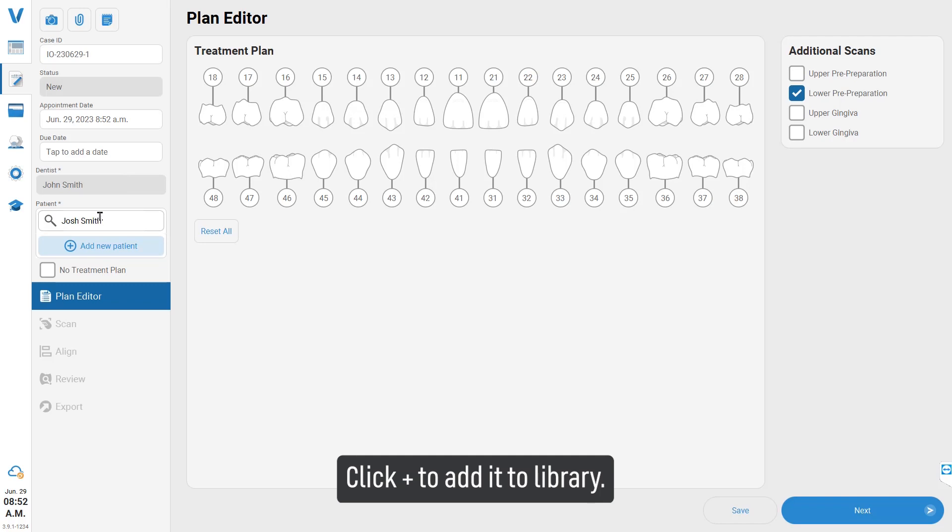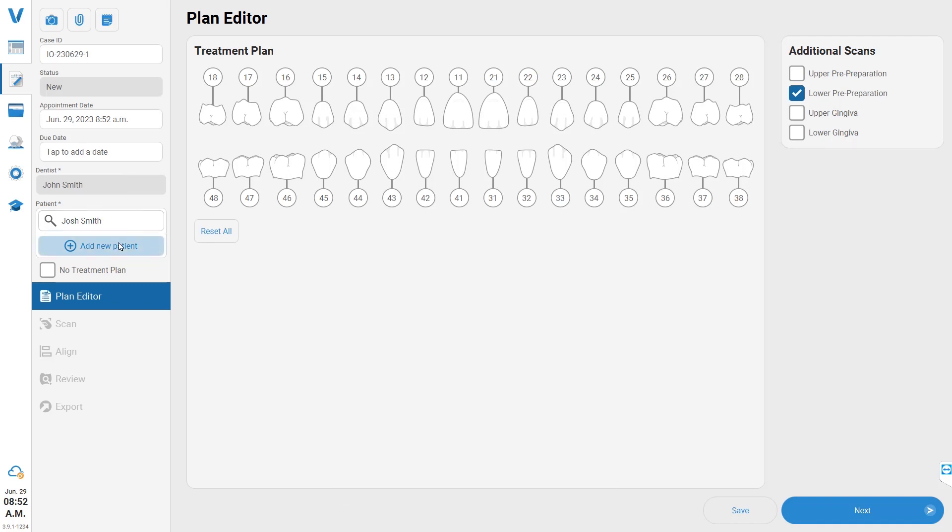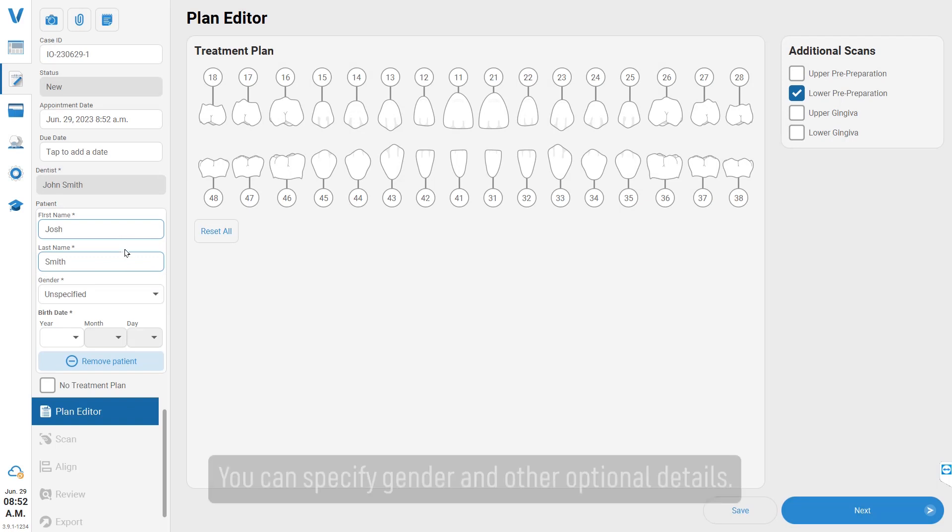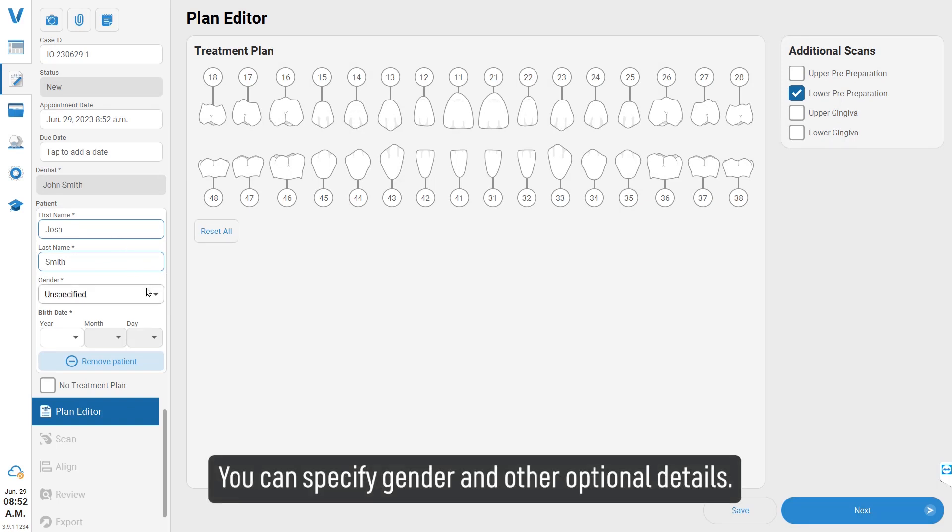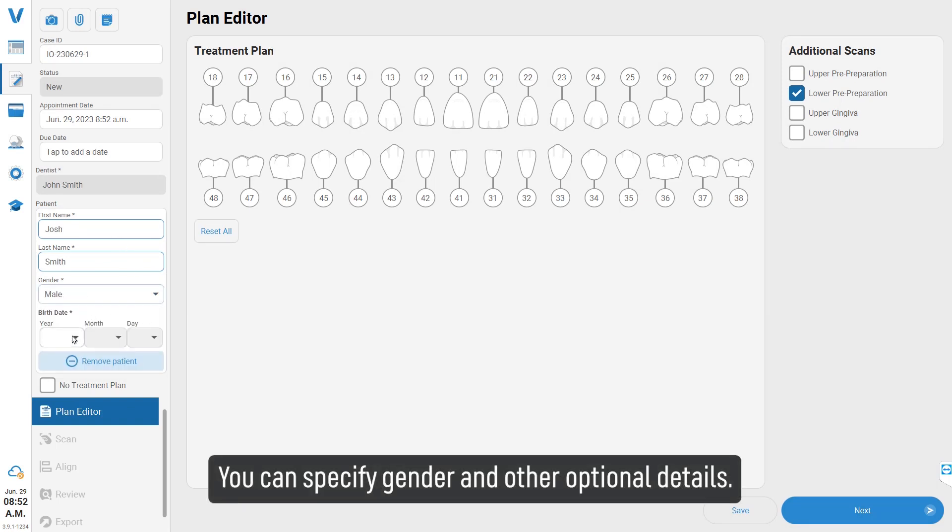Click the plus button to add it to the library. You can specify gender and other optional details.